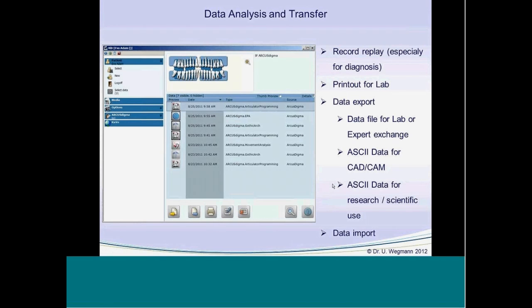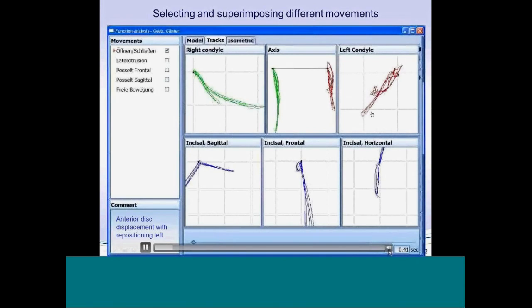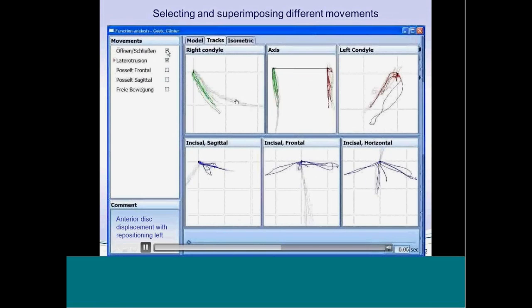As a short example for movement analysis, I only want to show you this registration. This was done with a patient with functional disorders. You can see these different kinds of movements, and if you have a little bit of experience, you can see what really is wrong in this left joint. The right joint looks quite good, but in the left joint we have some clicking and so on. And we can compare different measurements and a lot more.